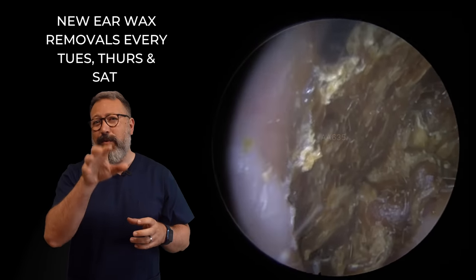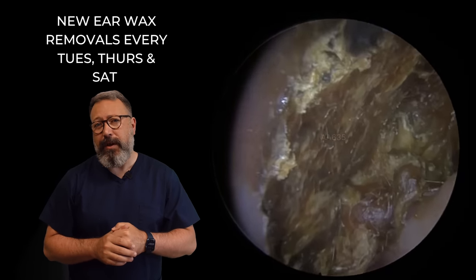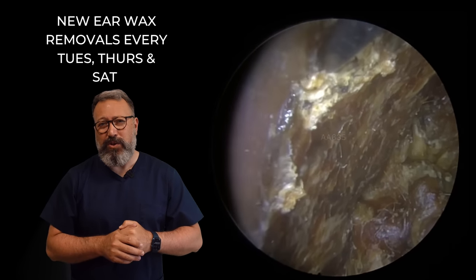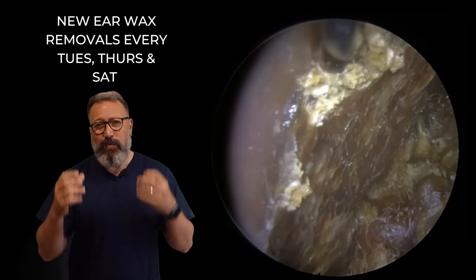We'll see that in a second. But what you have to have done is these have to be cleaned out on a regular basis for the majority of patients. And what we have here is a patient that hasn't had this done for about four years, so we've got a lot of very dry skin and wax in here.